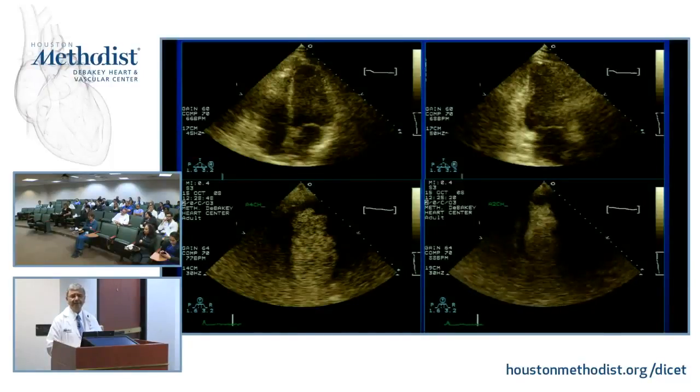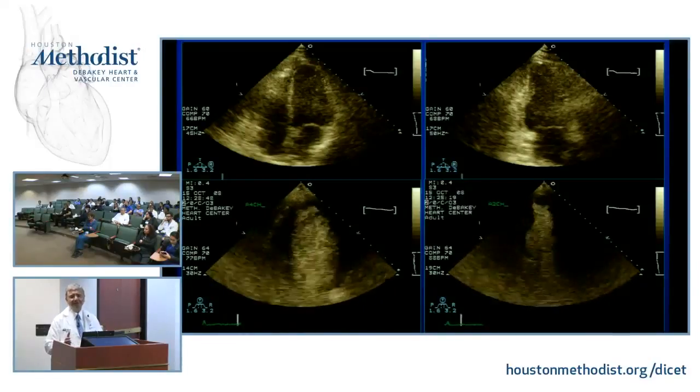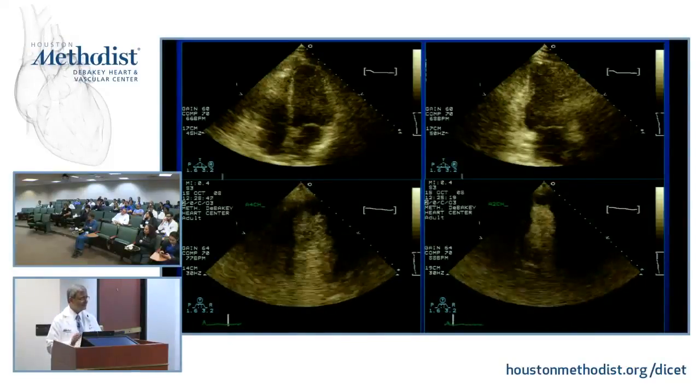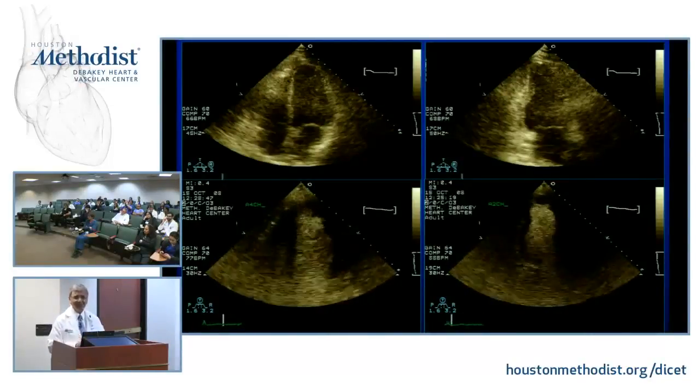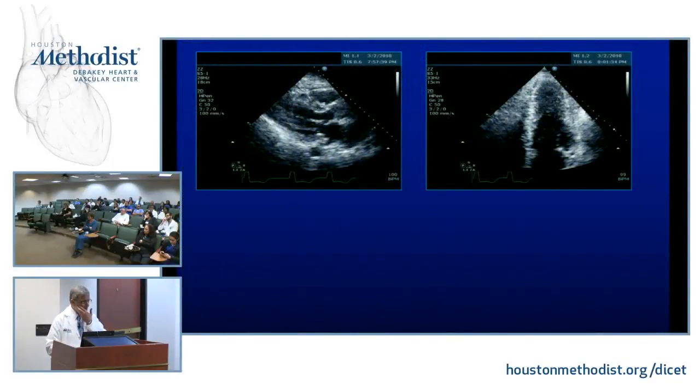Abnormality on top of that, and we have a thrombus on top of that. Isn't that interesting? And seemingly, what looks like, I wouldn't say completely decent, but semi-decent, with a small d, right? It is really amazing. So the more you see, the less confused you are, and the more accurate the diagnosis.